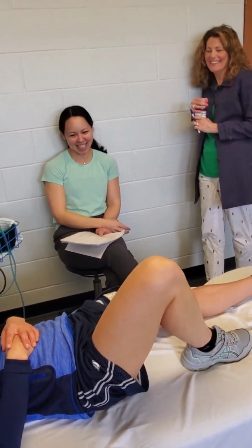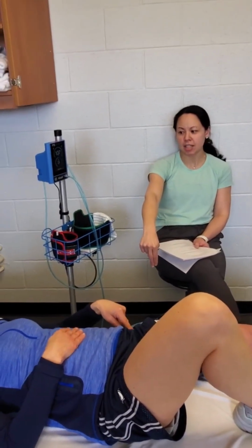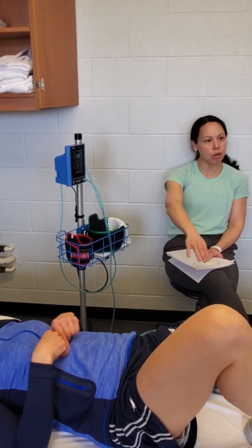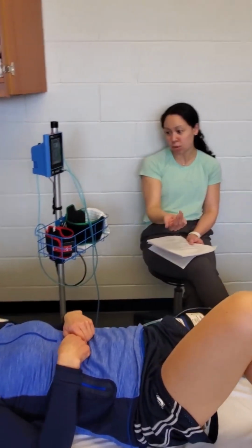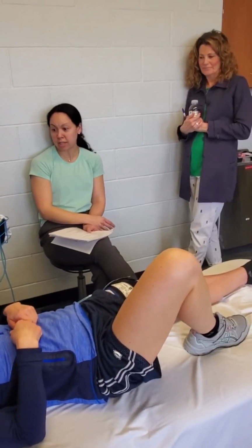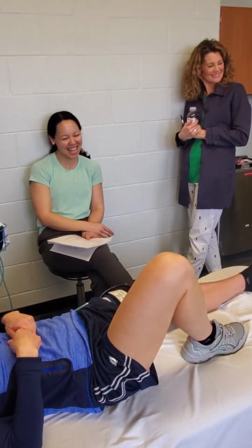But see, if she gets through 15 on her last set, I've never felt like I don't feel this kind of burn even when I'm working out. There's no blood flow. If she gets through this last set of 15, she has to add weight next time, right? So body weight might be too easy for you. If you aren't struggling through this last set, it's too easy for you. She doesn't want to seem like a punk though in front of us.